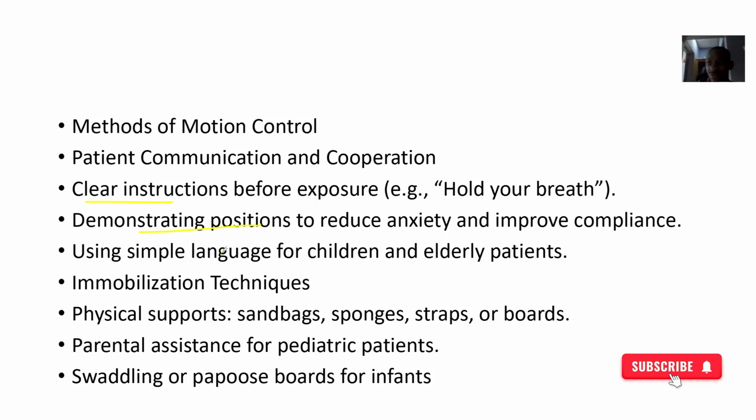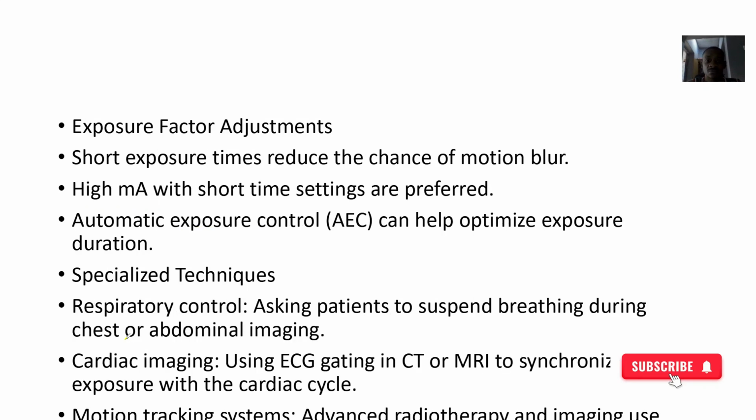Using simple language. If you are dealing with children or elderly people, you know that these are the extreme ages, so you have to explain everything in detail. Then immobilization techniques, where you use physical support. If it is a child, you make sure that maybe their parent is there so that everything is not all that strange to them.